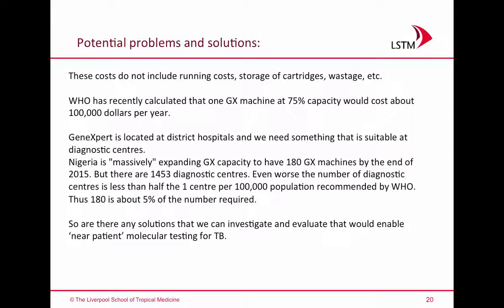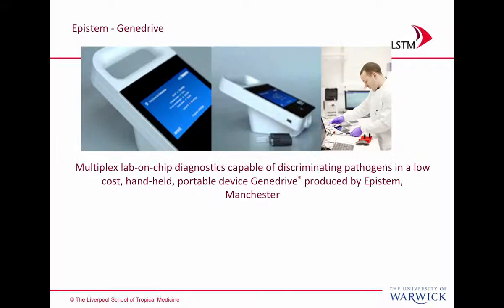Well, there are lots actually. There is a huge number of different PCR platforms and integrated lab-on-chip systems that are being developed, and companies can now see, with this huge enthusiasm and rollout of the GeneXpert, that there's really a market in producing these types of systems.